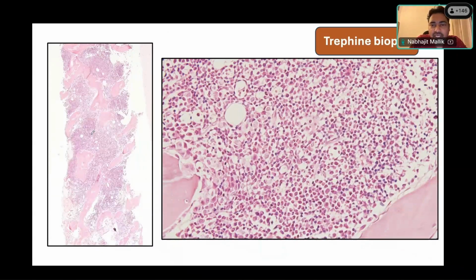Bigrai, can you tell me what you're seeing in the biopsy? Yes, sir. What do you see? The cells of erythrocytes are decreased actually, sir. Yes, that's what it is. What about cellularity? Cellularity seems to be normal. We are seeing some fat spaces here. You can see very few fat spaces, but for 4 months it could have been even lesser fat space. We are almost expecting no fat space at all, but still take it. There's more or less a normal cellular kind of a bone marrow. But again, what is most important is that we don't have too many erythroids at all here.